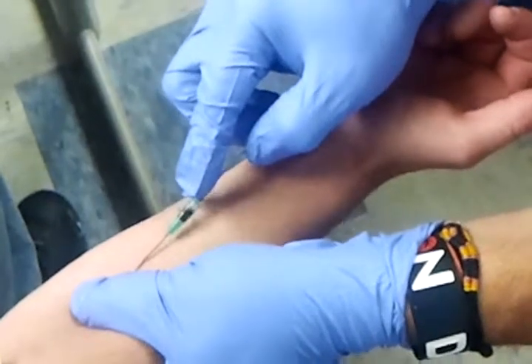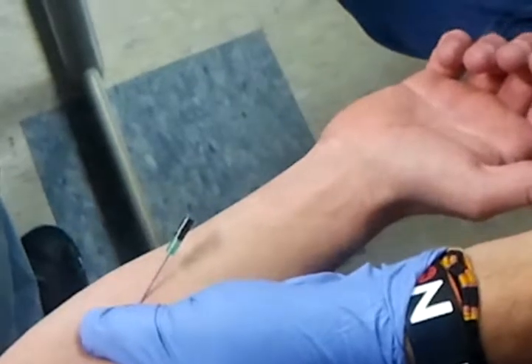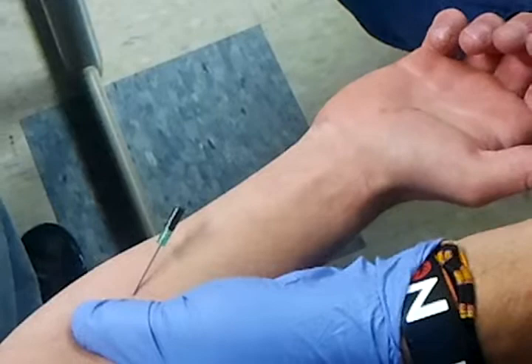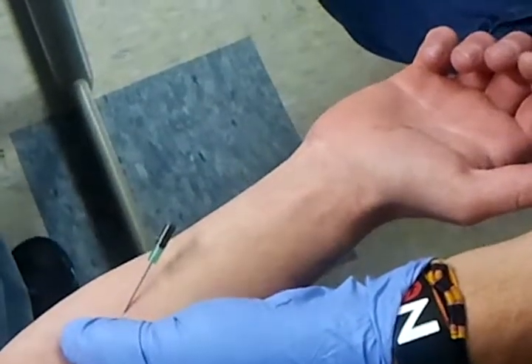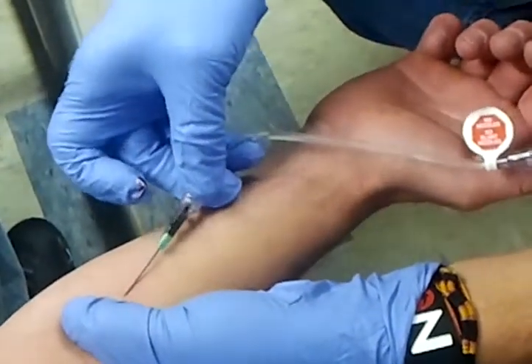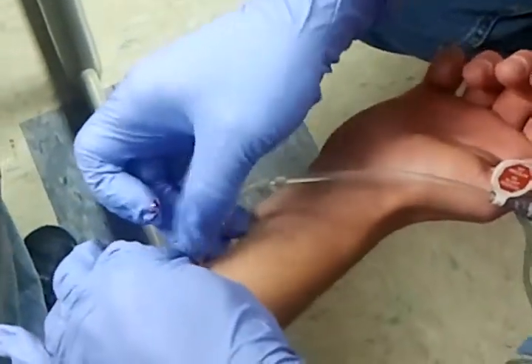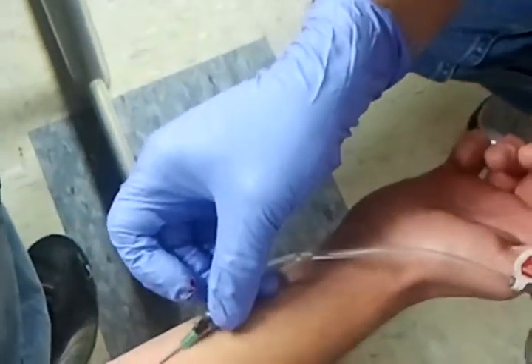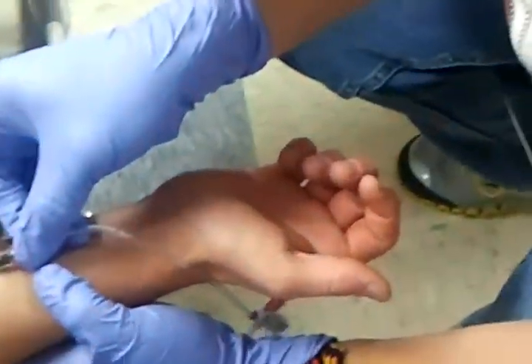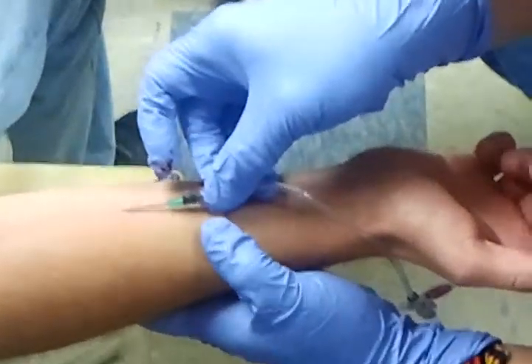This one's going to be real difficult because the IV catheter is so far out, but I'm going to see if I can float this one in. I don't think it's going to happen. Open it up. It's dripping slowly — got Steven Spielberg over here filming it.